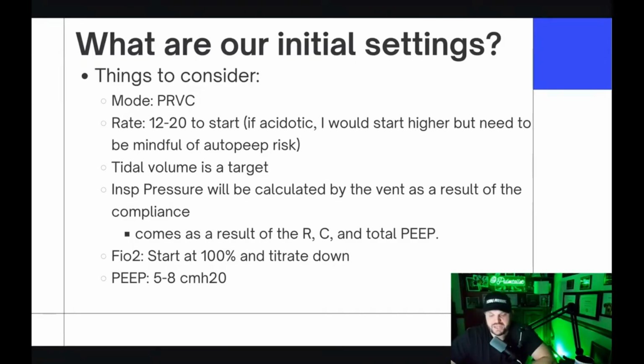If you intubated the patient because they had a high work of breathing, I wouldn't put them on a mode that decreases the support as the work of breathing goes up. That'd be counterintuitive. Furthermore, PRVC's claim to fame is that it gives less peak airway pressure. If you look at the studies, remember peak airway pressure is sort of irrelevant too. It doesn't really matter. What really matters is auto-PEEP and plateau pressure.